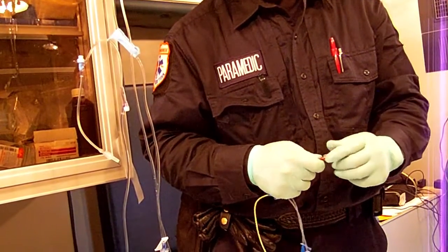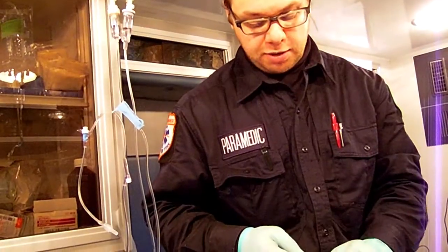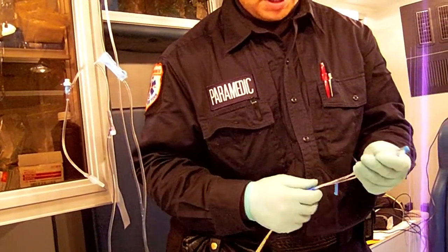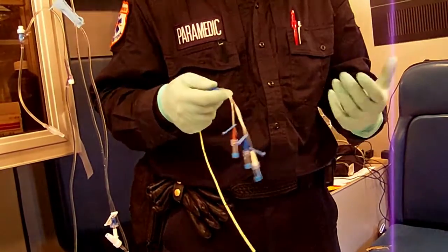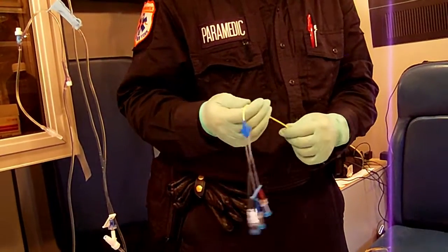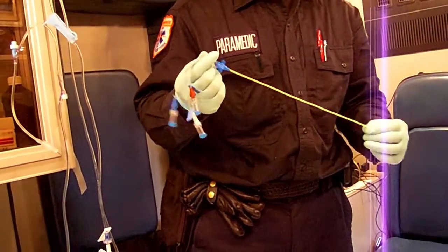If these ports are closed, they usually have heparin instilled — meaning they put in heparin to keep these lines from clotting. So before connecting your infusion, if there's nothing being infused, you don't want to just take this off and connect because you may push the heparin further in. You want to actually withdraw fluid — withdraw the heparin until you see a flashback of blood, and then you can connect your line. Also, with a central line you want good sterile conditions: wear a mask, sterile gloves if possible, and be very careful because this goes directly into central circulation and the possibility of sepsis, septicemia, or bacteremia is very high.